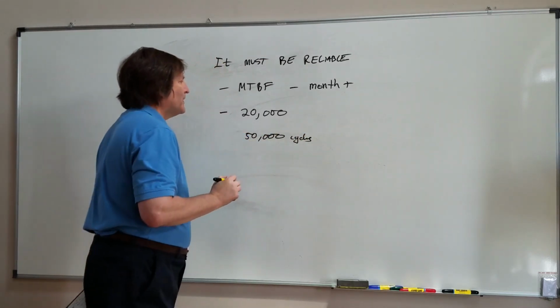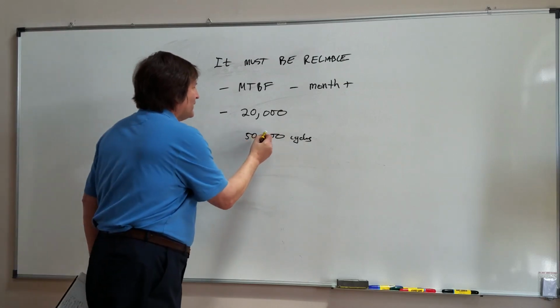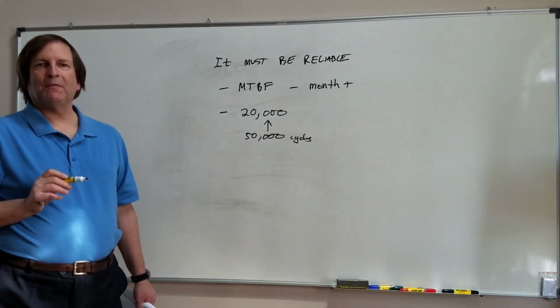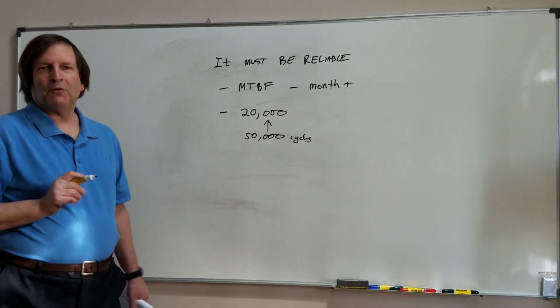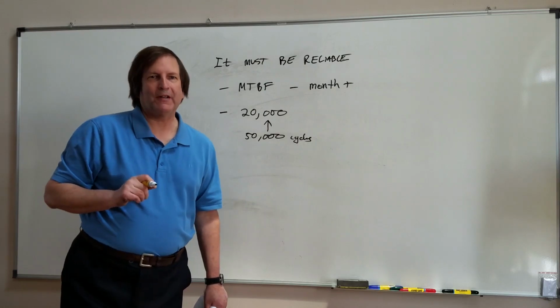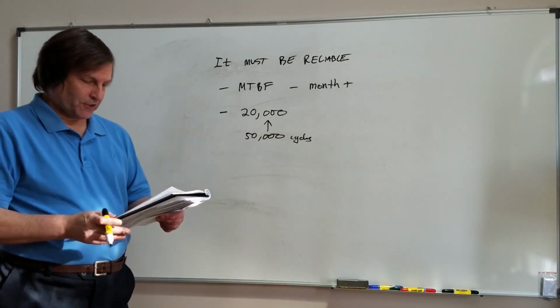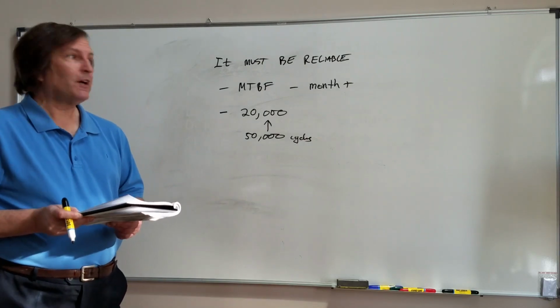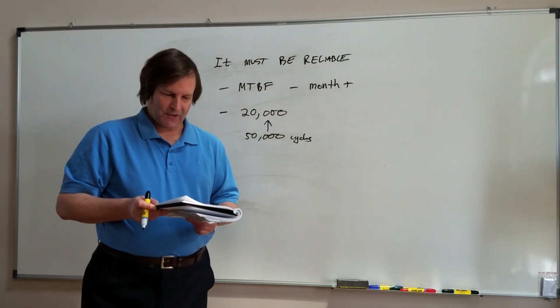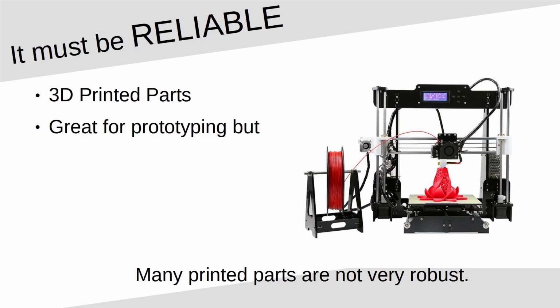If we were to use that switch in our ventilator and have it switched once every time we do a breathing cycle, it means our ventilator probably won't last more than 2 or 3 days before it breaks down. Not a good situation. So you've got to be very careful about the long-term mean time between failure ratings of the parts.